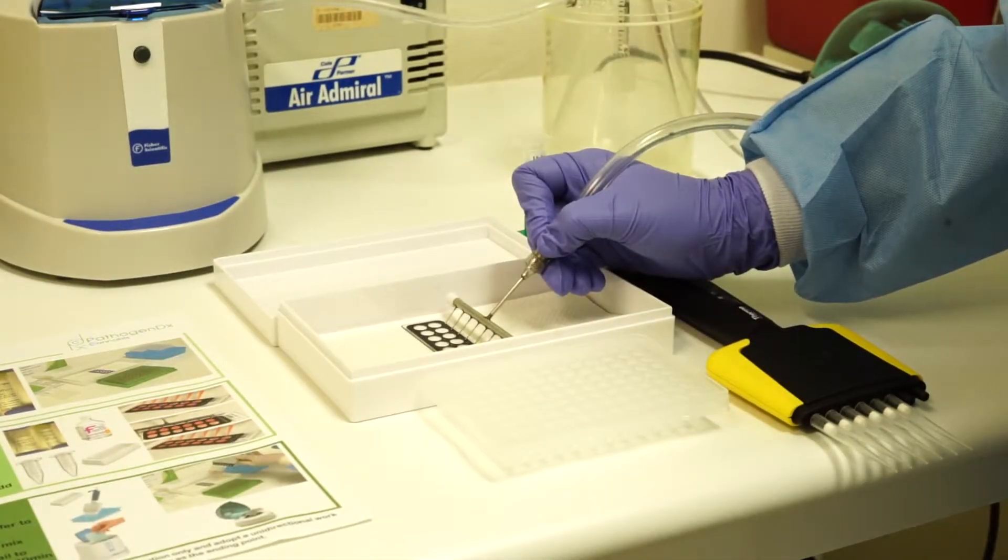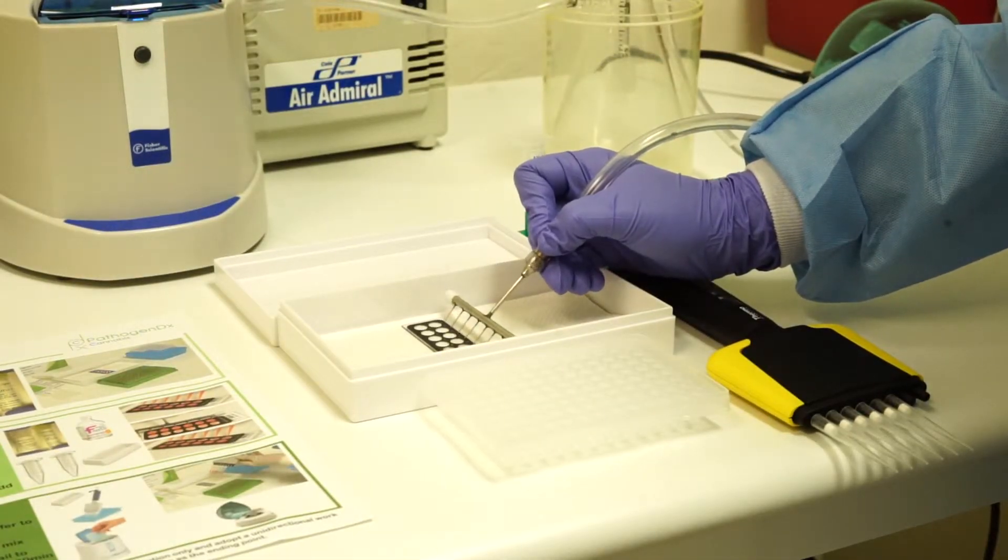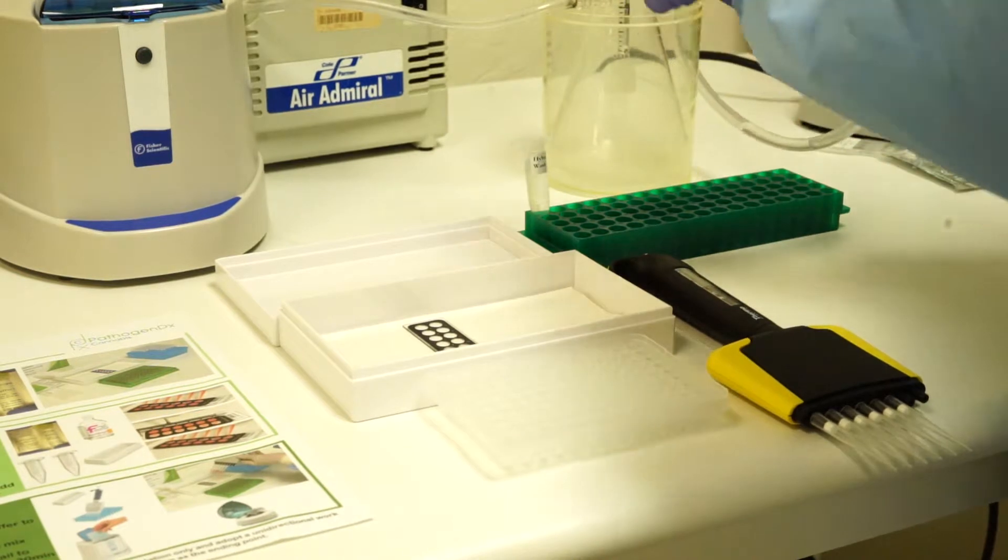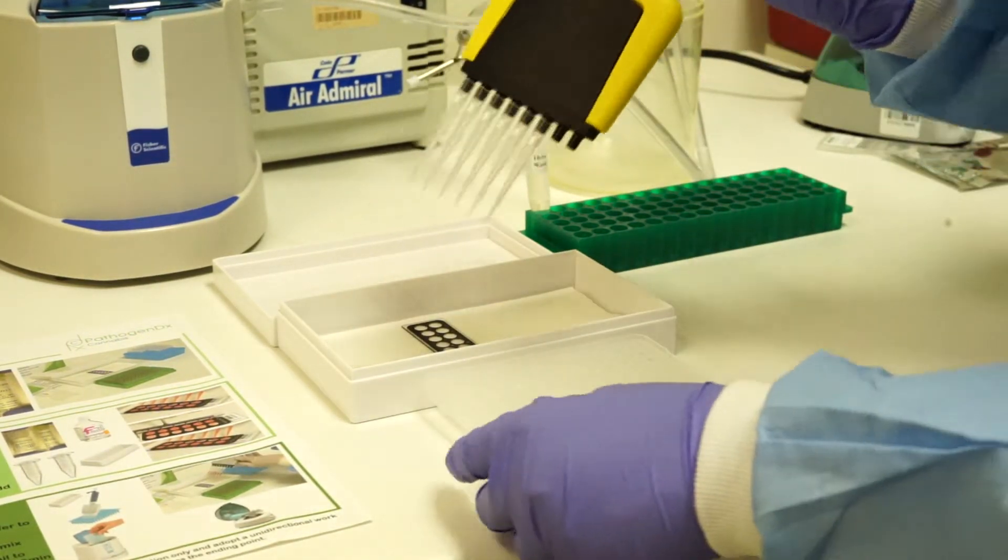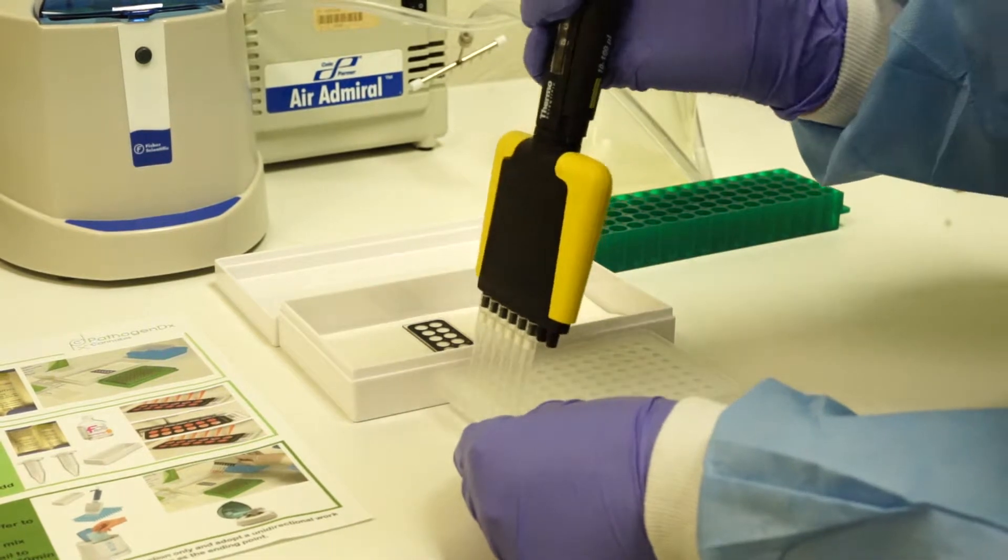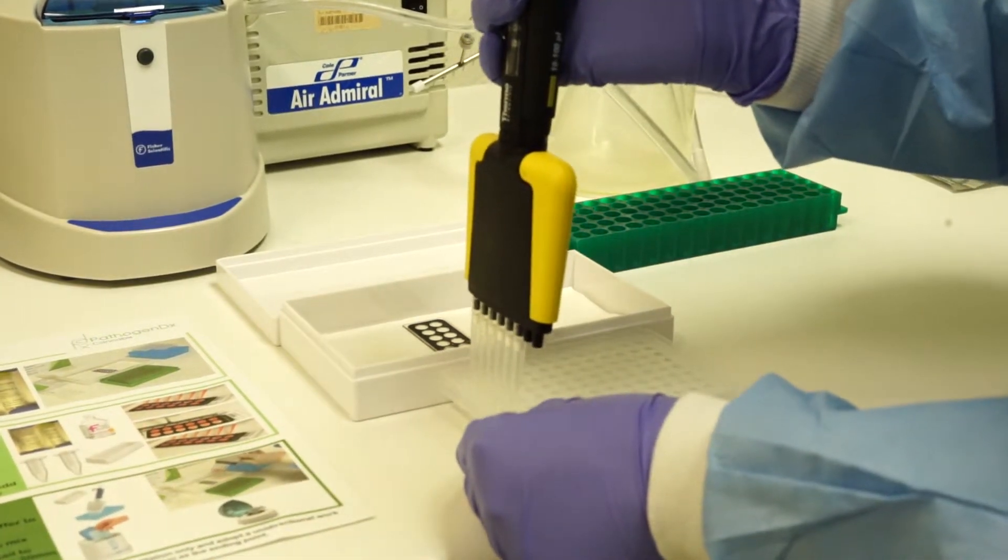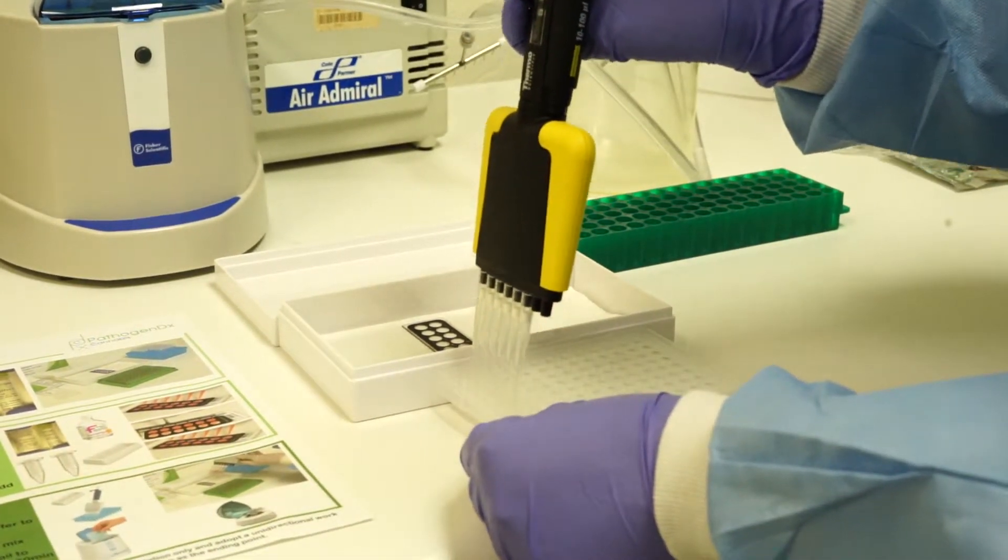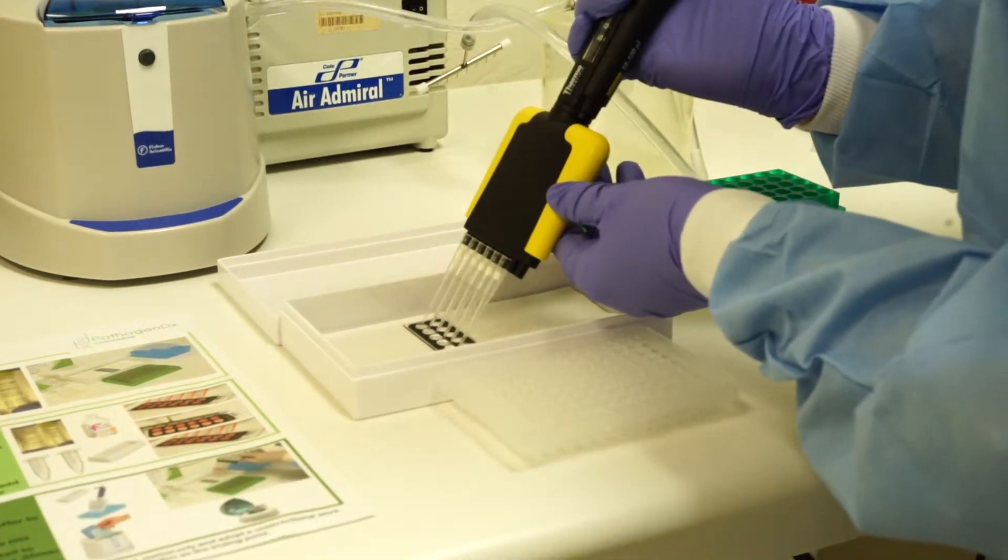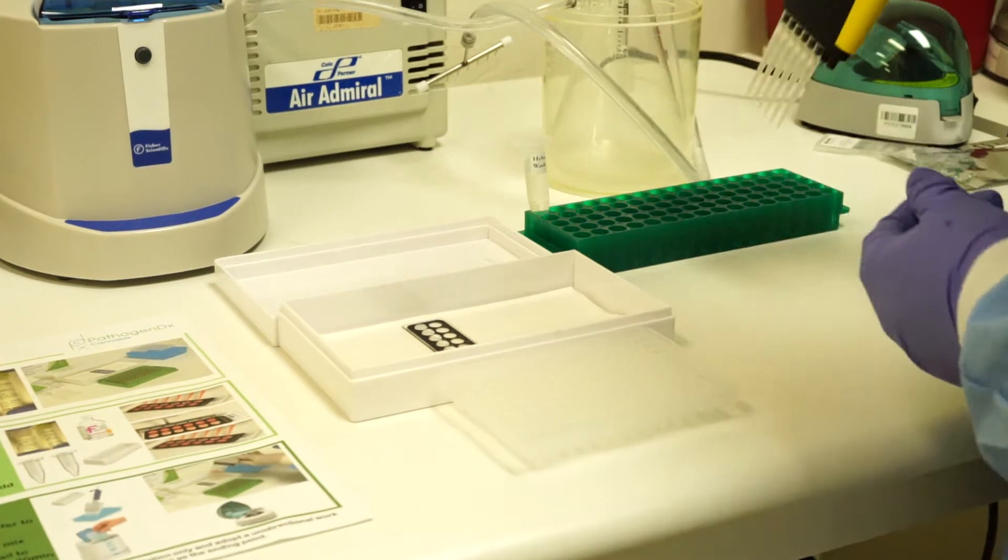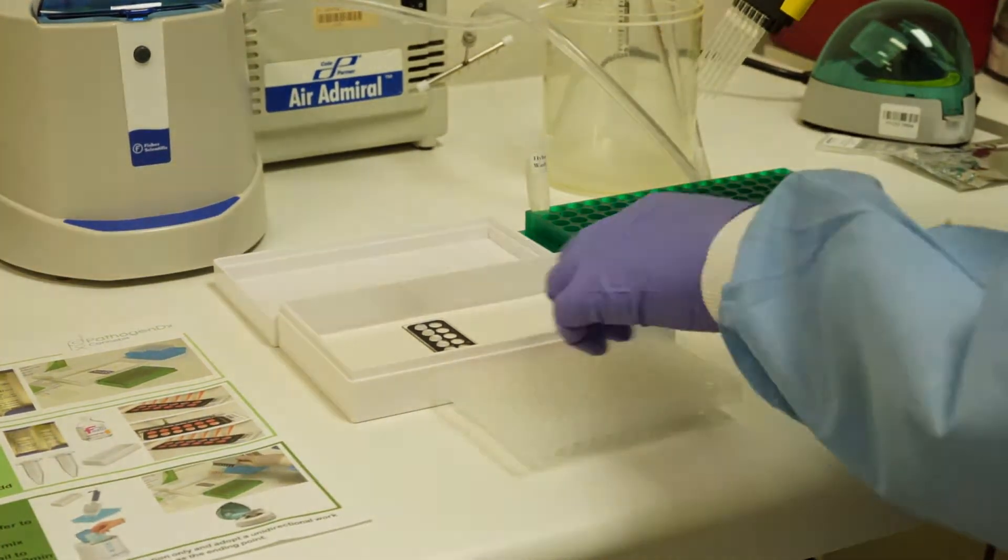After the five minute pre-equilibration step, remove the pre-hybridization buffer from the slide. Set your pipette to 50 microliters. Carefully remove 50 microliters from your PCR plate, which now contains the hybridization cocktail, and dispense slowly onto your slide. Avoid any contact with the surface of the slide.